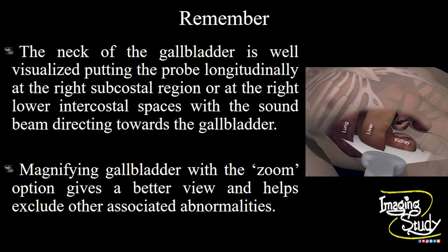The take-home message: the neck of the gallbladder is well visualized by putting the transducer longitudinally at the right subcostal region or right lower intercostal spaces, with the sound beam directing towards the gallbladder. This is an excellent technique to evaluate the neck of the gallbladder and to exclude the presence of any stone at that point. Magnifying the gallbladder with the zoom option of your machine gives a better view and helps exclude other associated abnormalities like polyp or mass.